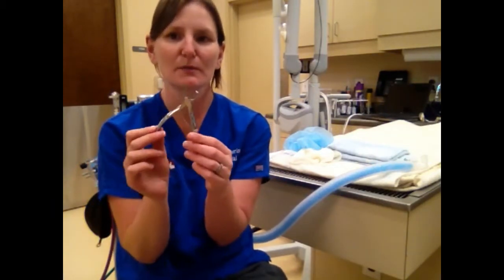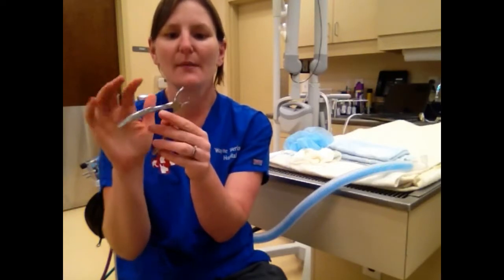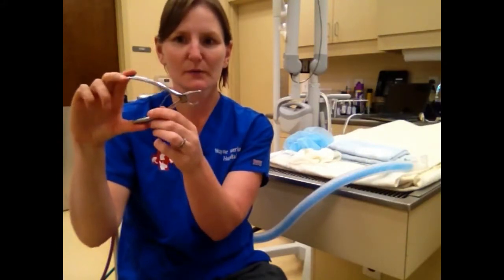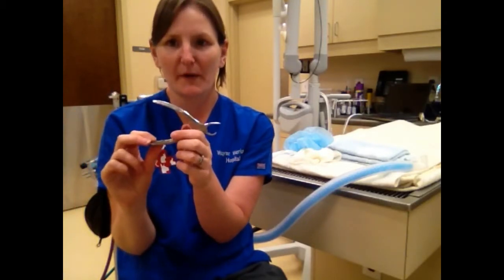These forceps are used to remove large chunks of calculus from the teeth at the beginning of the dental. So this long edge goes against the crown of the tooth, while the short edge goes underneath the calculus. We would squeeze those together and they break off large chunks of calculus.